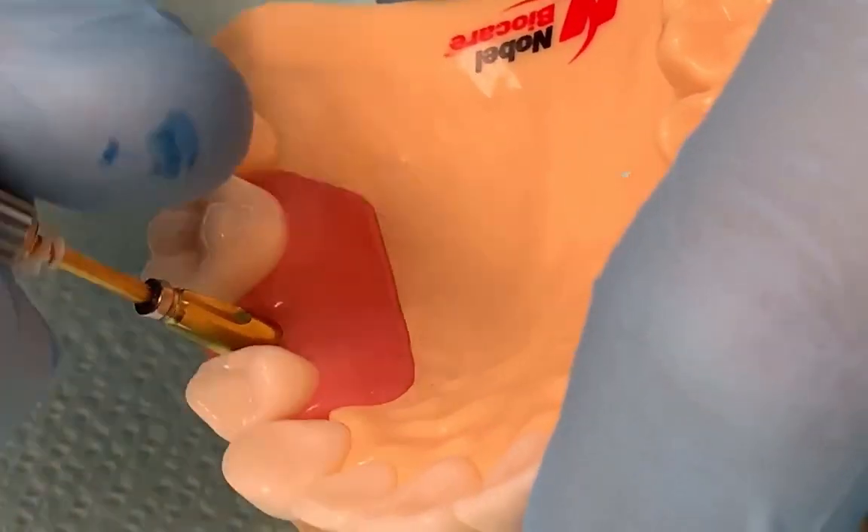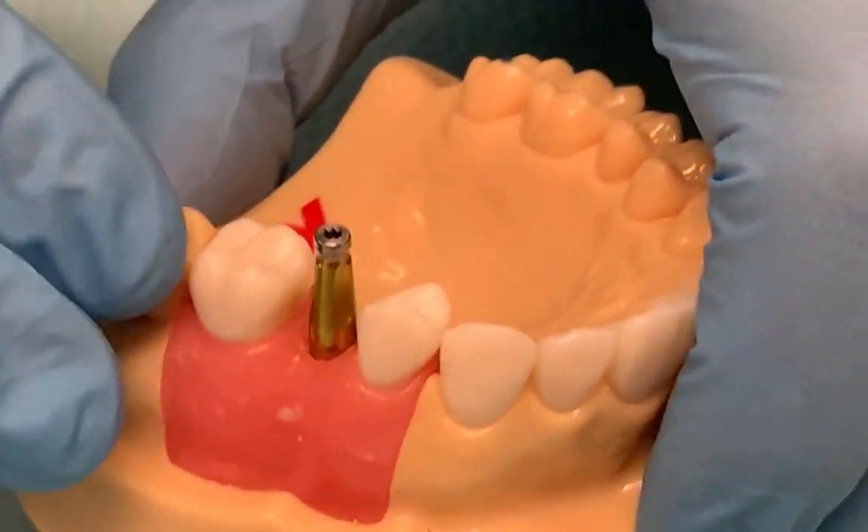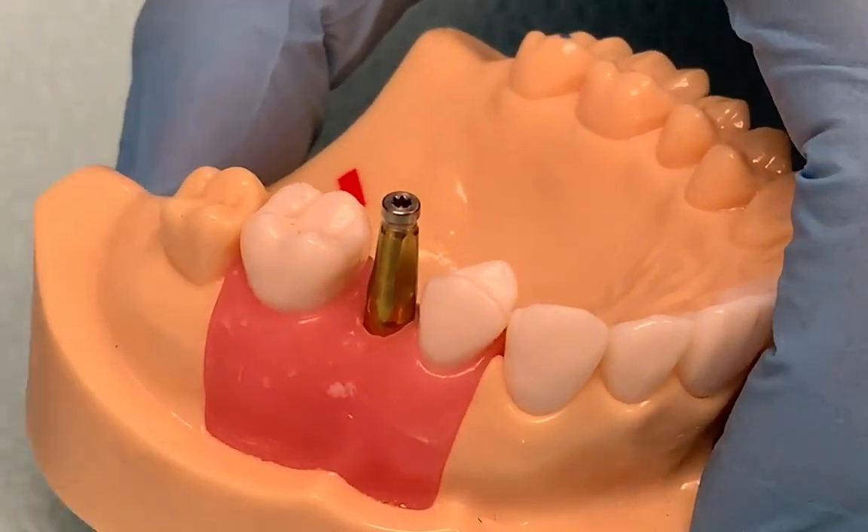You have to make sure it's really tight. And then you're going to take a radiograph to verify that the impression coping is seated fully.